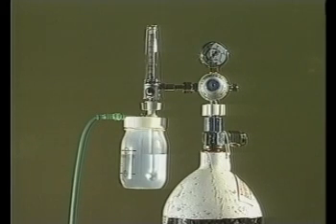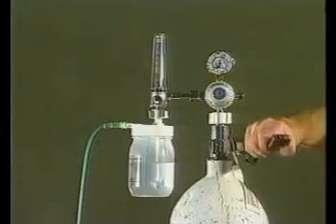In this section of the program, we will look at the recommended equipment for giving oxygen to a child. We will also look at how to connect up and use the equipment.